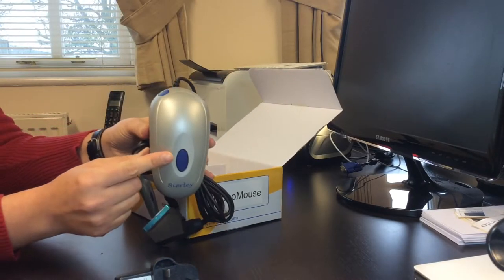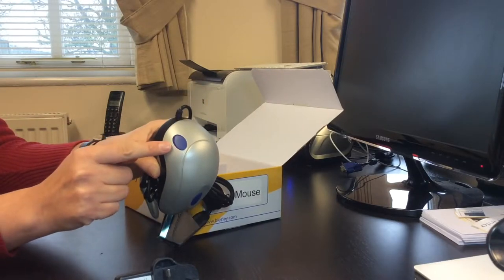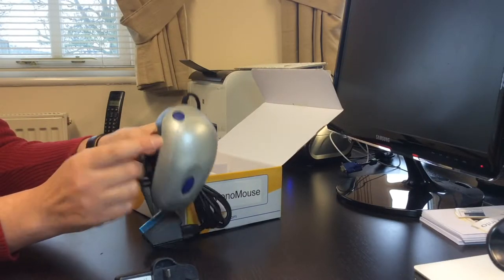On the mouse there are two buttons: a large button in the middle to turn the mouse on and off, and a slightly smaller one located near the back to change the mode.